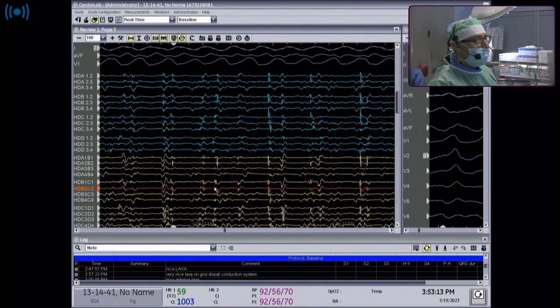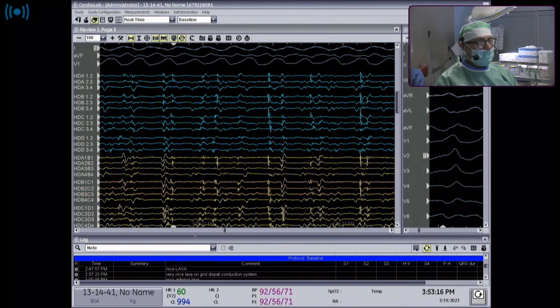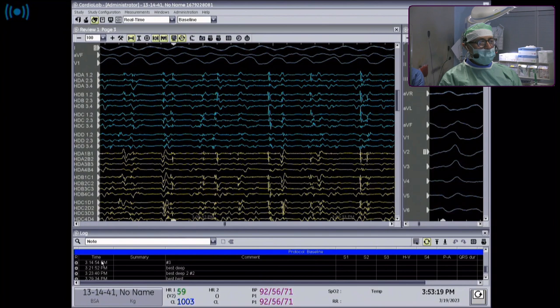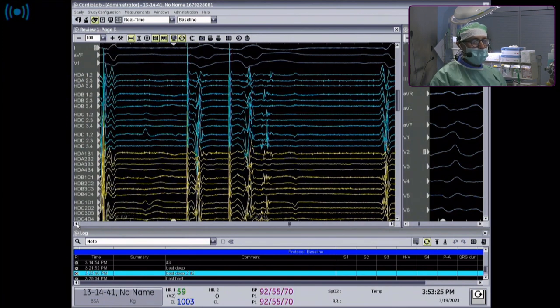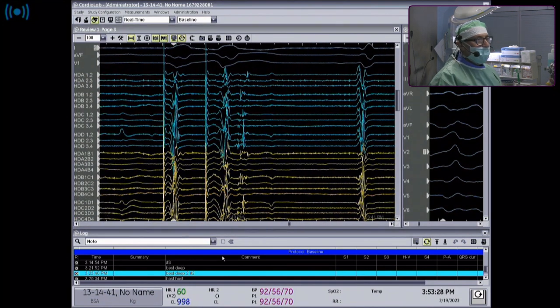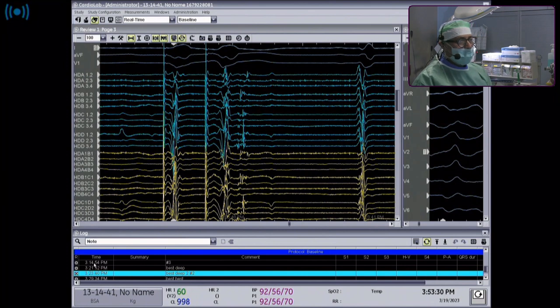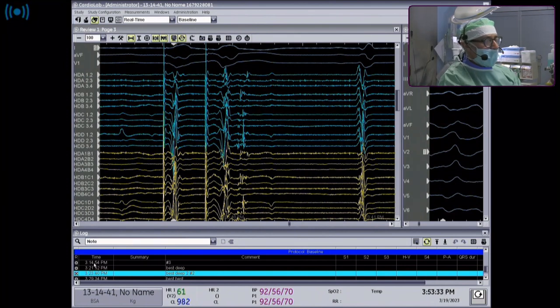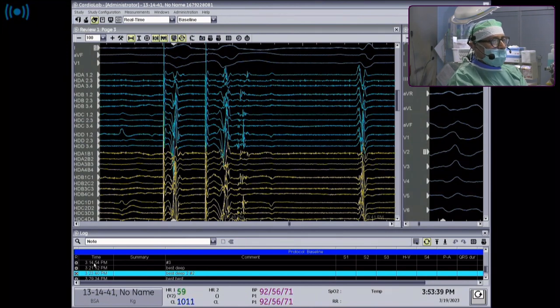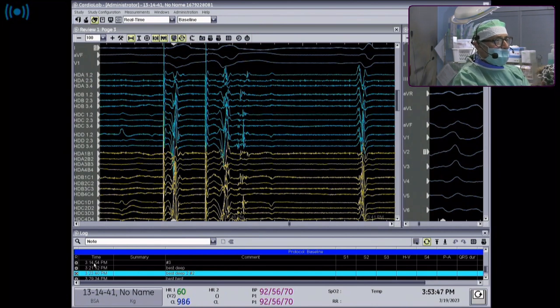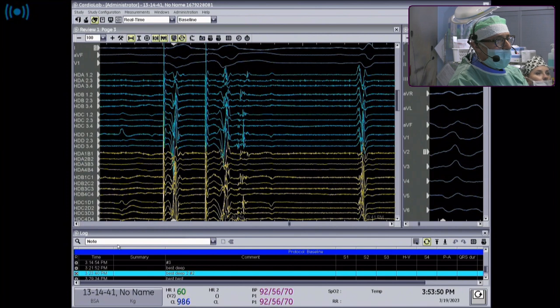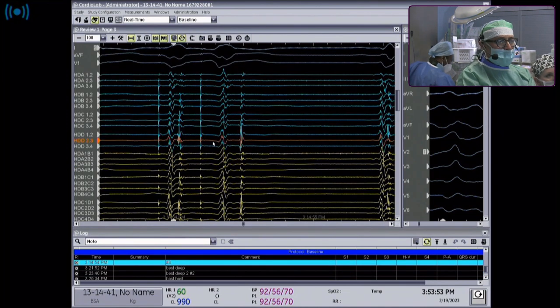That brings us out of the possibility of targeting a single re-entry mechanism. So we decided to go with mechanistic deep mapping: we set pacing at 600 milliseconds and after a drive train of six to seven beats, a premature at 300 milliseconds - in order to have capture - and Federico is showing areas of delay of potentials evoked by the premature, showing different areas of substantial conduction delay that will probably be used as targets for ablation.